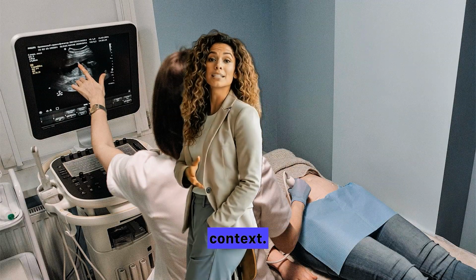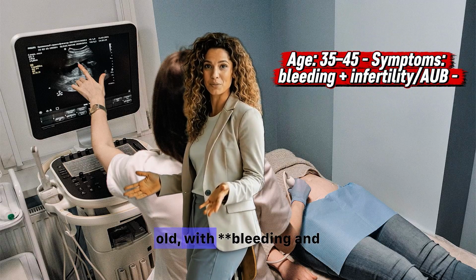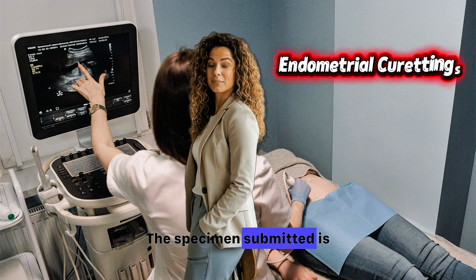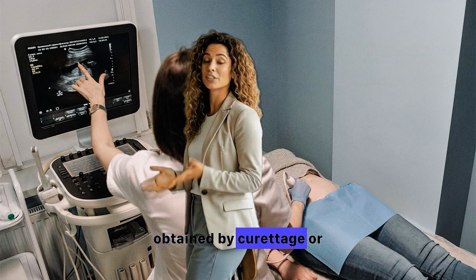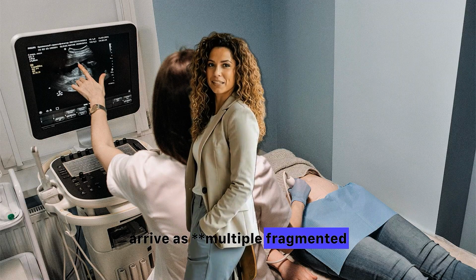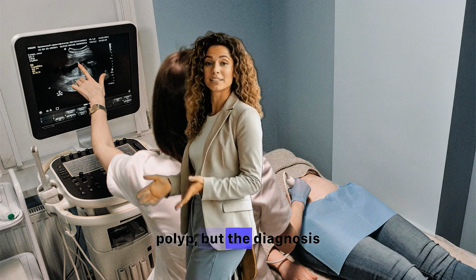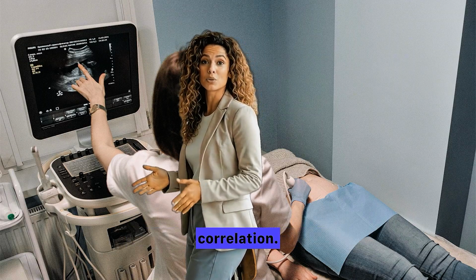Here is the case context. The patient is around 35 to 45 years old, with bleeding and infertility, or AUB. The specimen submitted is endometrial curettings, meaning tissue obtained by curettage or a D&C. A key learning point is that curettings often arrive as multiple fragmented pieces, so you may not receive one intact polyp, but the diagnosis is made using the microscopic pattern and clinical correlation.